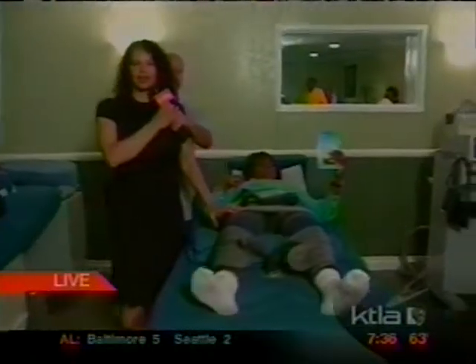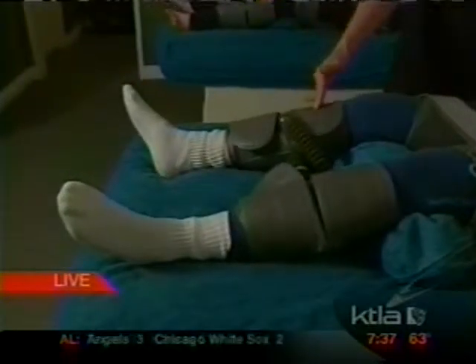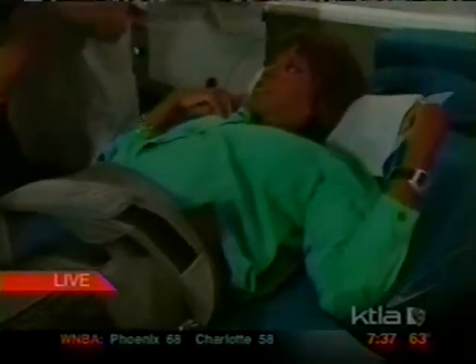The name of the treatment is called Enhanced External Counterpulsation. It's an FDA-approved treatment. It's been around since the 1960s. It was invented at Harvard, but it's been FDA-approved since 1995. What you're actually seeing are blood pressure cuffs wrapped around the calves, the thighs, and buttocks. The pulsing that you're hearing is timed to the rhythm of the heartbeat. When the heart is at rest, these cuffs squeeze from the calves, thighs, and buttocks and move all the blood from the lower extremities throughout the whole body, helping with lowering blood pressure and people who have blockages in the artery.